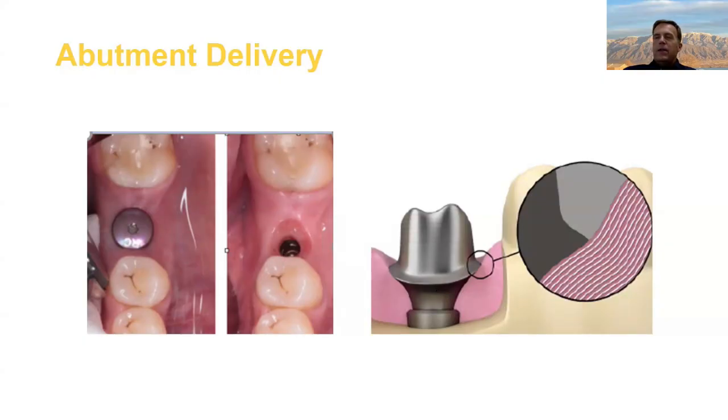And it kind of depends on the implant system. Some implant systems are designed so that the fixation screw won't grab until the anti-rotational components in the platform are engaged. Some are not that way. And so you can start tightening the screw and the abutment will pull down, and instead of engaging, let's say, the hex, it's sitting on top. So now your abutment's up about 1.5 millimeters, which is not good.